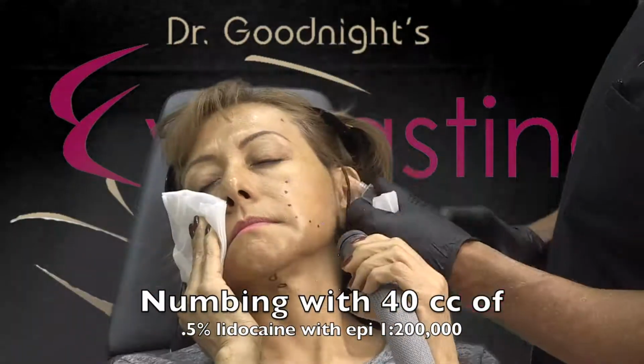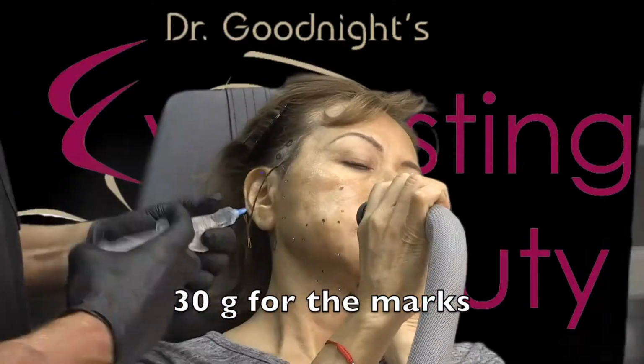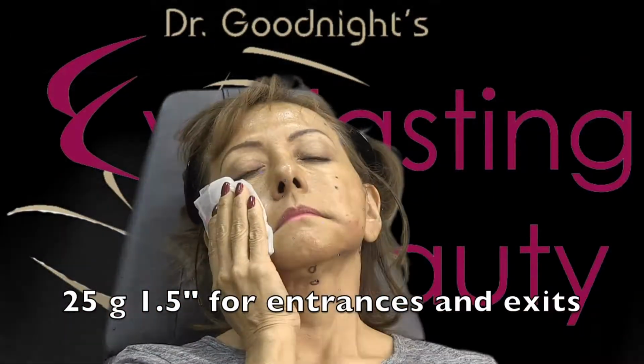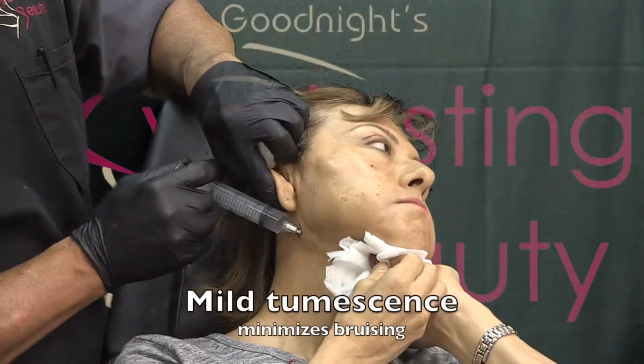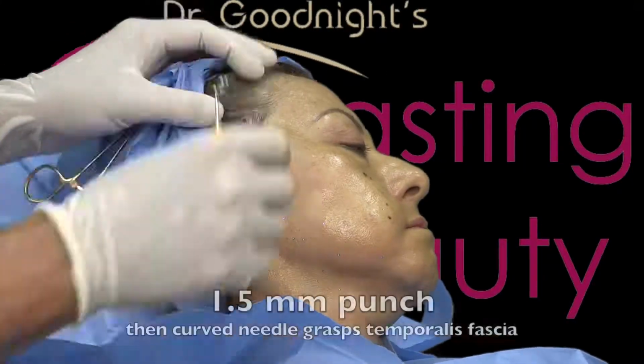First, you numb with about 40 cc's of 0.5% lidocaine with epinephrine, 1 to 200,000. You can use 30 gauge for the entrances and exits, and then you come from above and below with the 25 gauge 1.5 inch needle, and you place it in the deep sub-Q, and you do the same thing in the neck. This minimizes bruising. Then you put on a head drape.